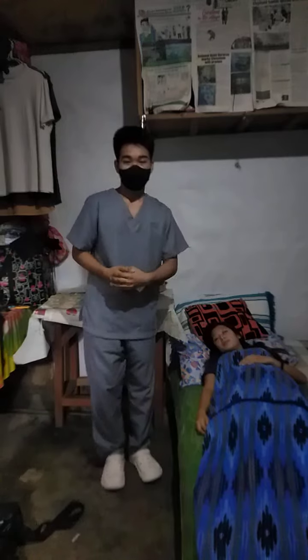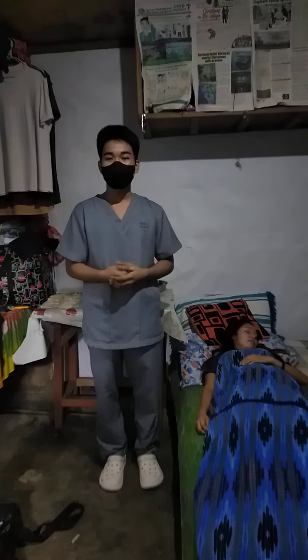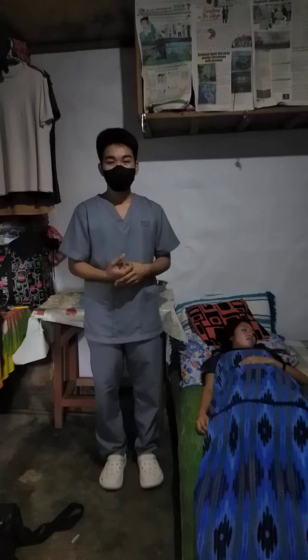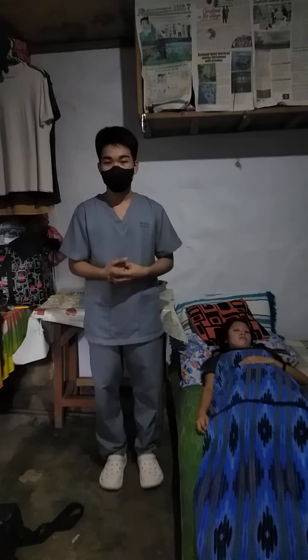Thank you po. Next is to gather equipment and select the appropriate NG tube to provide an organized approach to the task. The NG tube should be radio-opaque, contain clearly visible markings for measurement, and may have multiple ports for aspiration.